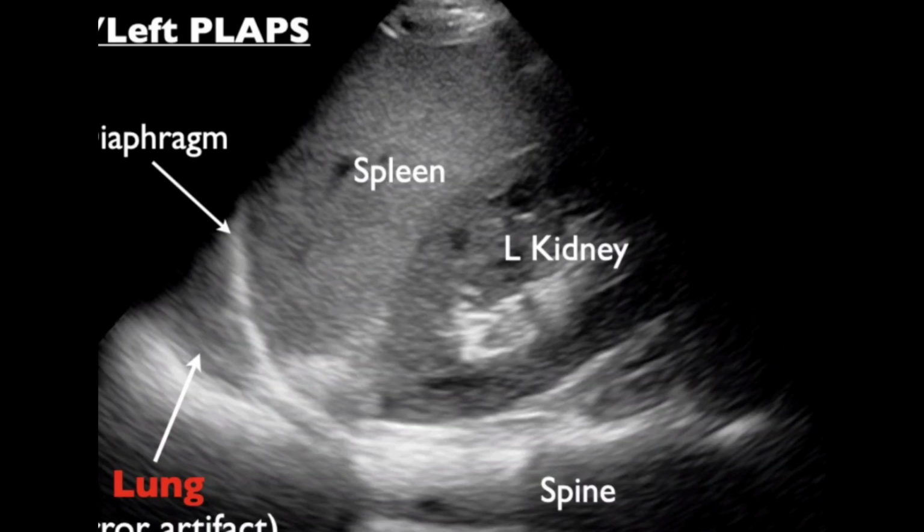In this image, the spleen border is making an interface with the diaphragm. On this image, you can appreciate a bright reflective line that is actually the diaphragm. Behind the diaphragm, aerated lung is visible. In this area, you can pick up even minimal pleural effusion of a few millimeters, while X-ray is unable to pick up this amount of pleural effusion. In this image, you can see the spleen's relationship with the left kidney and the diaphragm, and you can also appreciate the aerated lungs.